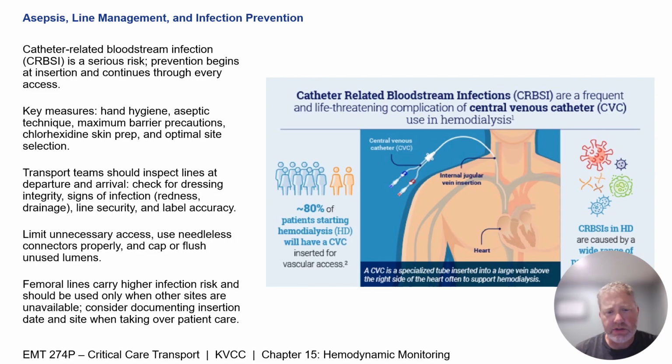One of the biggest challenges that you'll face is keeping these lines aseptic, managing the lines, and preventing infection. Infection prevention and line safety are major parts of hemodynamic monitoring because every invasive device creates a pathway for complications. Strict asepsis during insertion and every subsequent access reduces catheter-related bloodstream infection. Dressings, securement, port cleaning, minimizing unnecessary manipulation, all of those things matter.